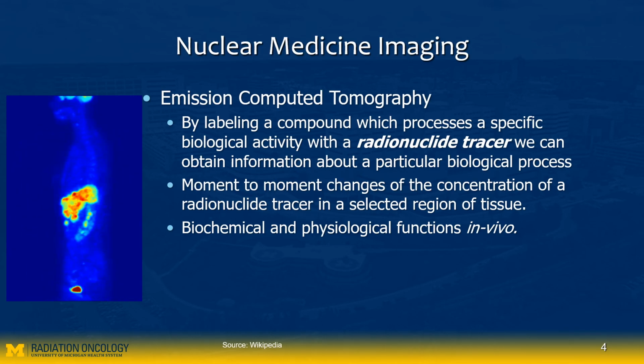So in general, nuclear medicine imaging is quite different from general X-ray based radiology imaging. It is based on emission imaging, and emission imaging can be reconstructed into three dimensions, so you can call it emission computed tomography.